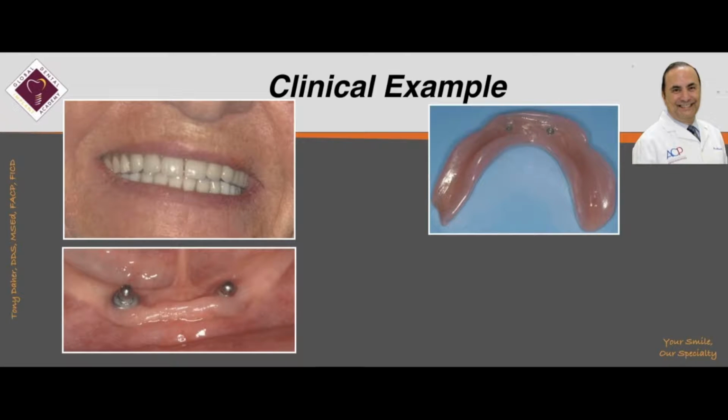When you look at the mandibular denture that the previous dentist made, certainly there is a problem with the anatomy of the flanges and so on. We know for a fact that you have to cover certain primary support areas. If you remember from dental school, the primary support area is mostly the retromolar pad, and it's not a resorbable area, because it's the attachment of 4 different muscles. So we have to cover that area to give some support in the posterior ridge areas. Also the buccal shelf.